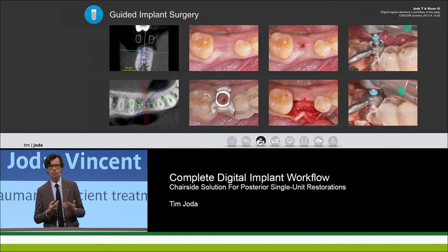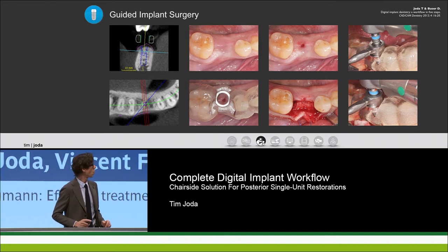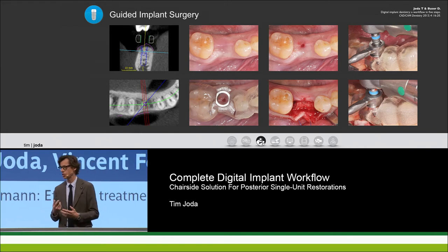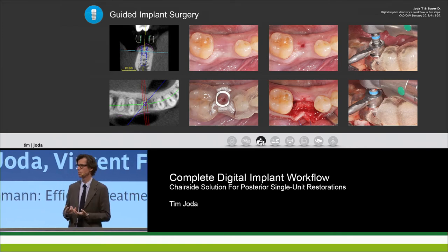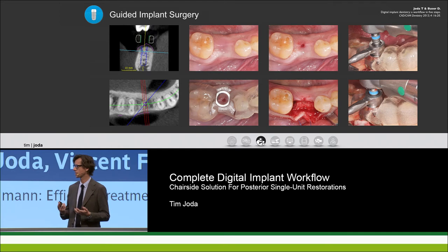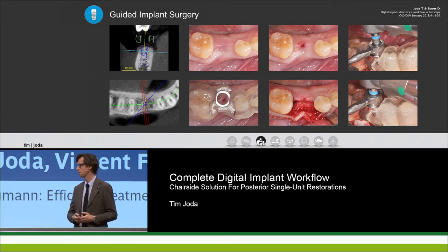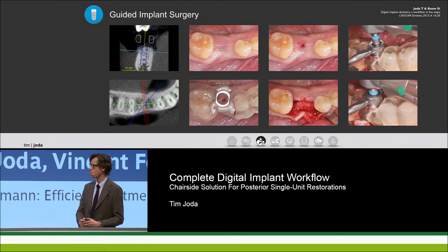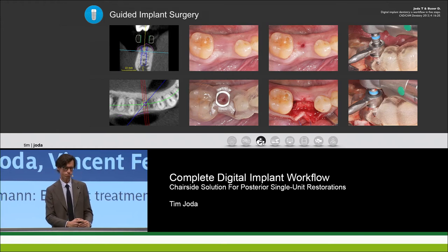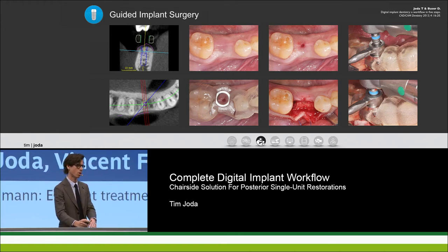It's a straightforward case, and I like to have an implant restoration that is screw-retained. Vincent, as a dental technician, is it possible in this position? Absolutely — looking at the implant angulation, we will definitely be able to end up with a screw-retained reconstruction.